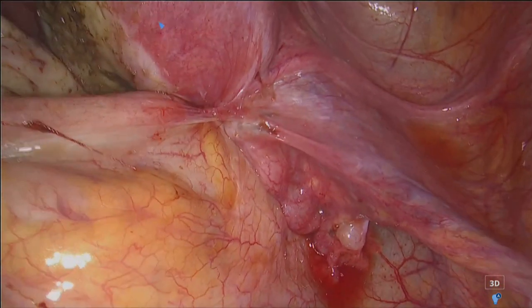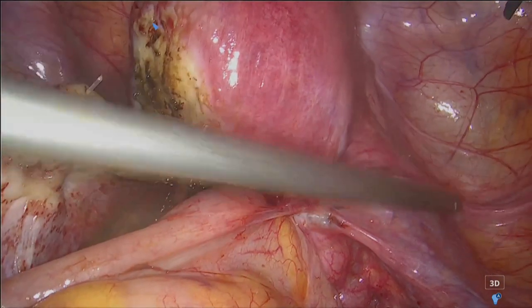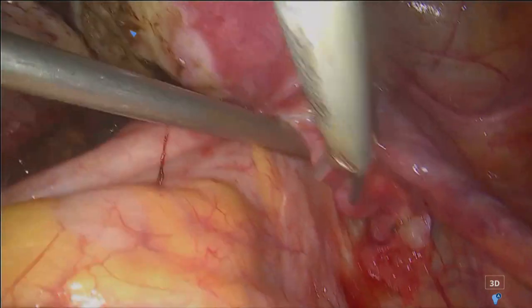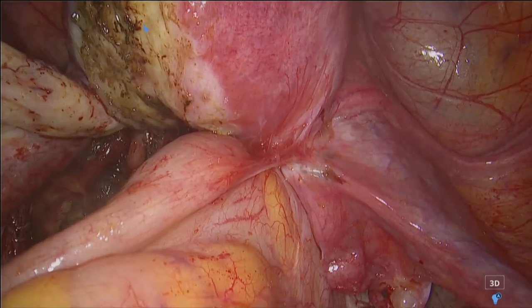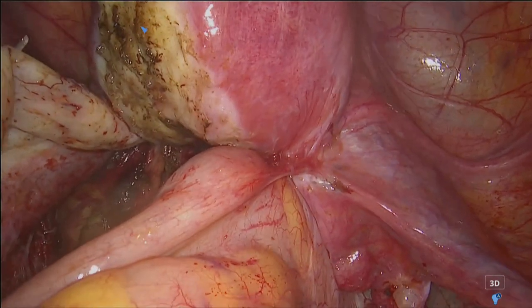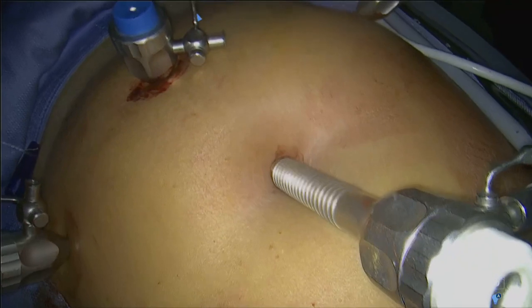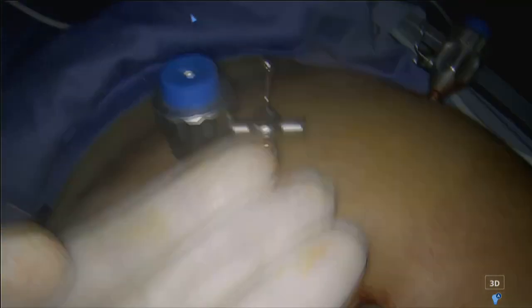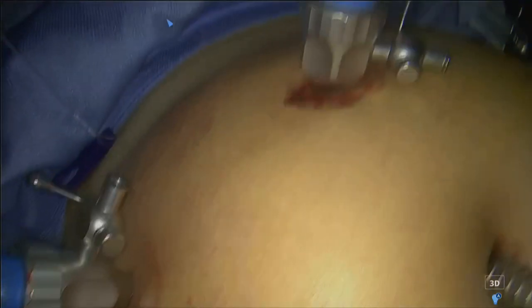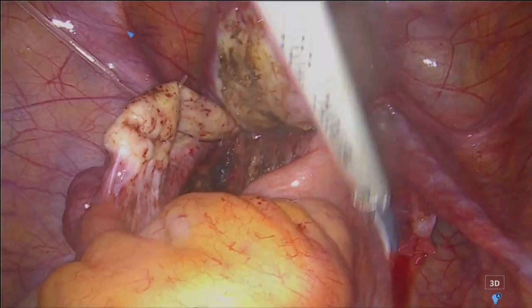And another question from Dr. Caban Alfaslan. It's about the position of the port entrance of the trocar, if we change the position regarding the sites and the weight of the patients. Usually we try to use not so low entry. This is the typical position with the 11 millimeter trocar in the umbilical port area inside the umbilicus, and down 3 or 4 fingers in the same line, a 3-5 millimeter port. And usually we can do any kind of surgery with this position of the trocar.